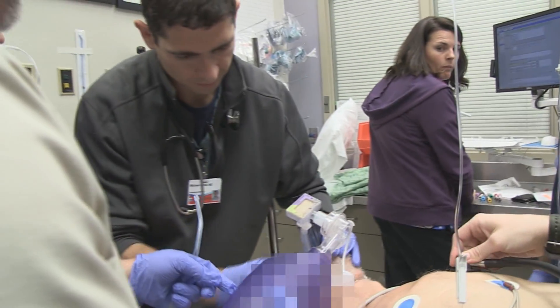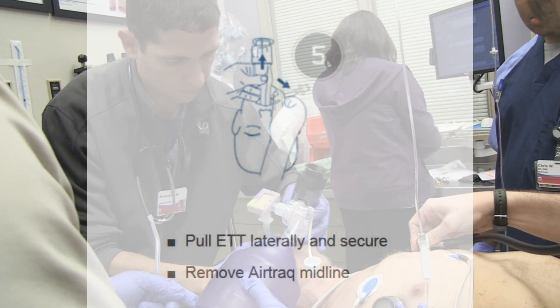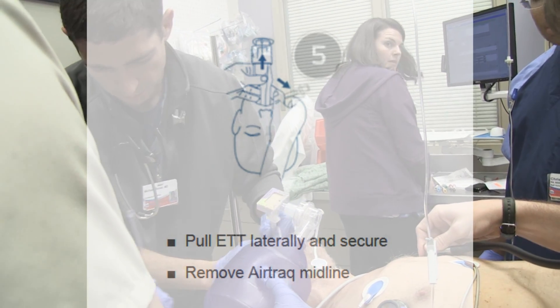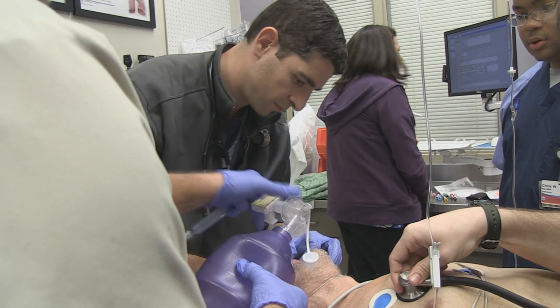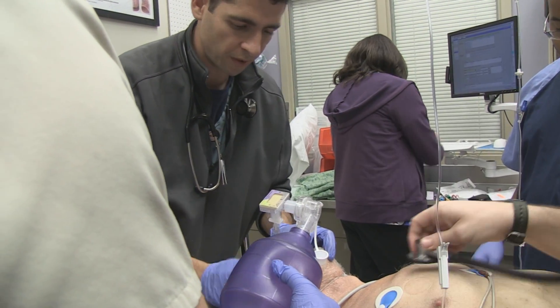All right, how did you get your scope out now? It hops off. So your first success with the air track. That was good. We're 21 at the T.